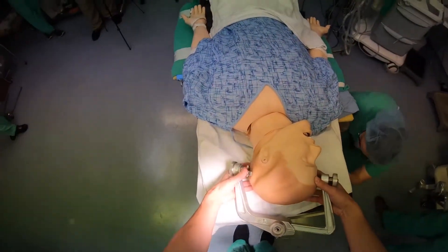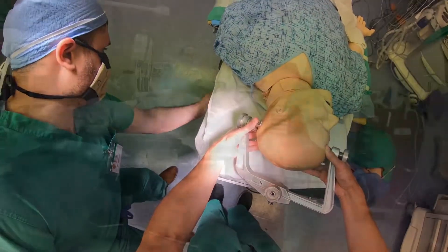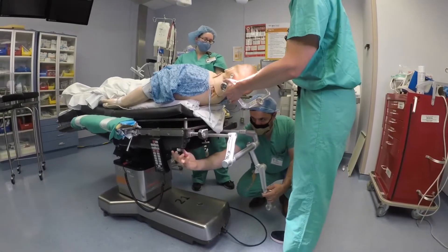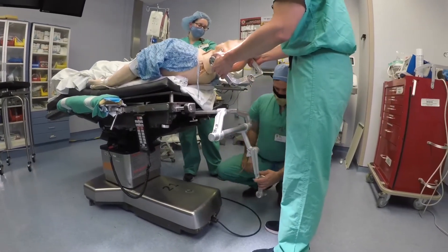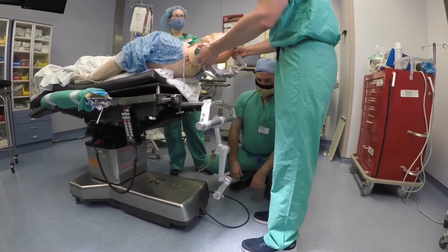Now that the patient is firmly pinned, we continue to support the head, then lift the head up by the pins and remove the head of the bed. Tighten everything down — you want four tight screws, both on the adapter and to the bed itself. Since you're often doing this upside down, righty-tighty and lefty-loosy will be reversed.